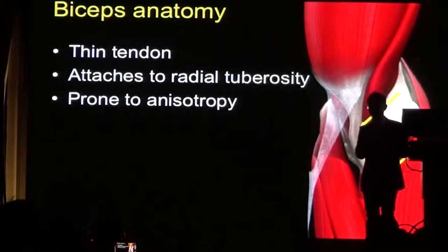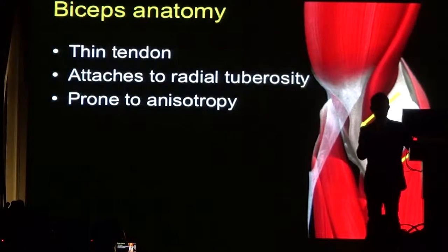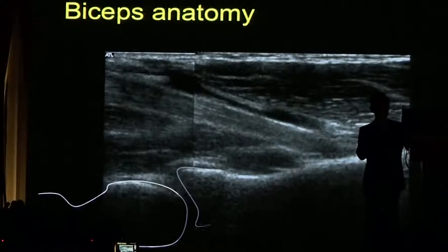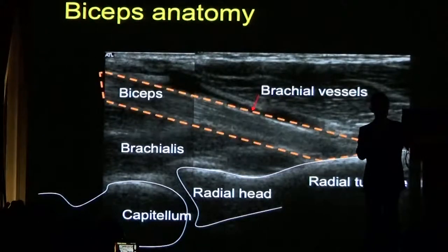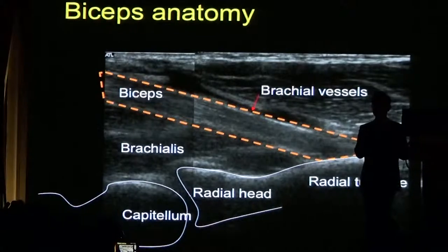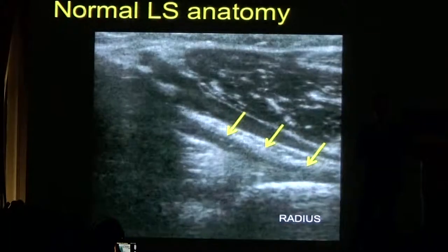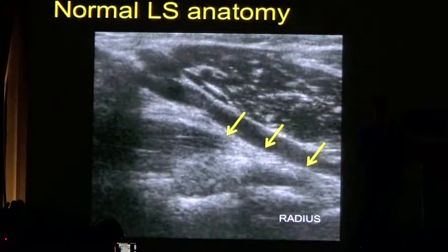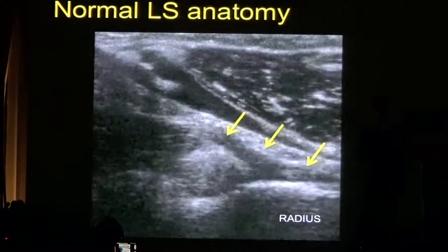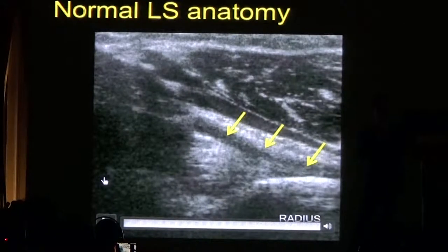The biceps tendon is a difficult structure to examine on ultrasound because it's a very thin tendon and prone to the artifact of anisotropy. We should be able to see a nice fibrillar structure that attaches to the radial tuberosity. The brachial vessels lie anterior to the long head of biceps. As we scan longitudinally, the arrows point to the long head of biceps, and you can see that the insertion is some distance from the radial head itself — the radial tuberosity is a few centimeters away from the joint.